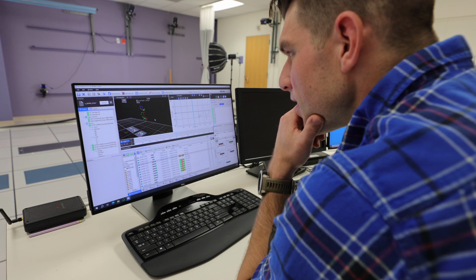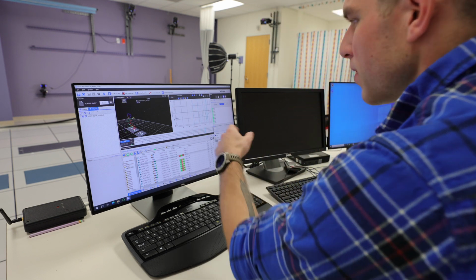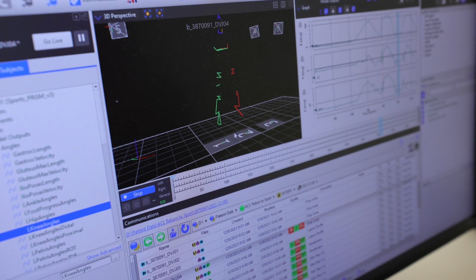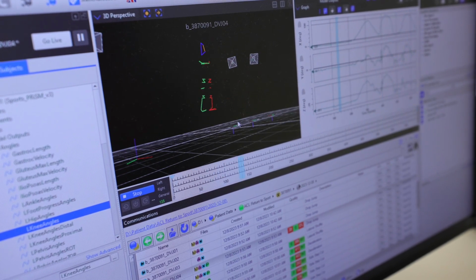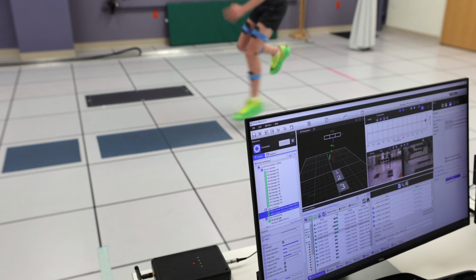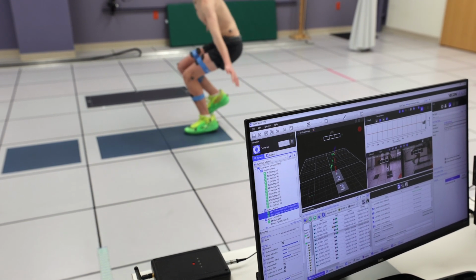A motion analysis lab is a clinical assessment lab that takes motion capture data, ground reaction force data, and electromyography or motor control data and integrates all of that into a multidisciplinary report that's used for informing surgical decision-making, physical therapy optimization, and treatment best practices for each individual patient.